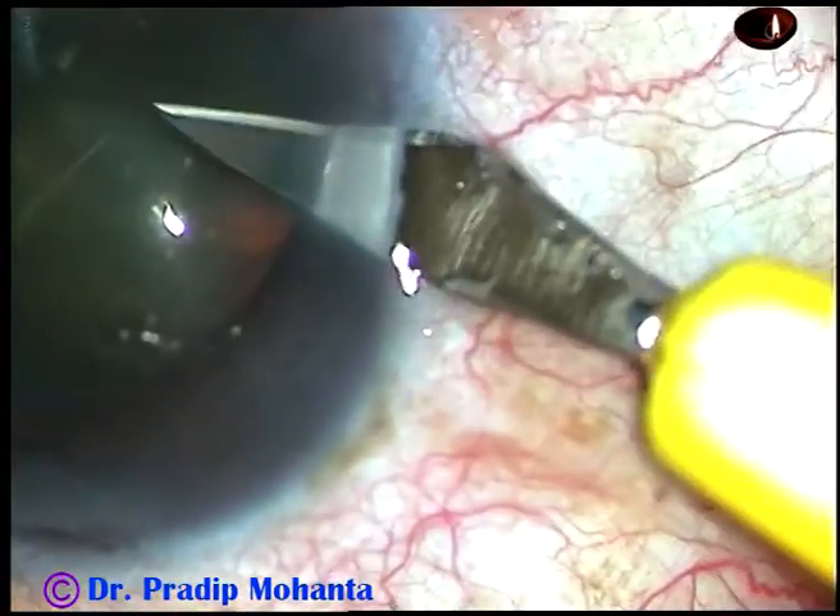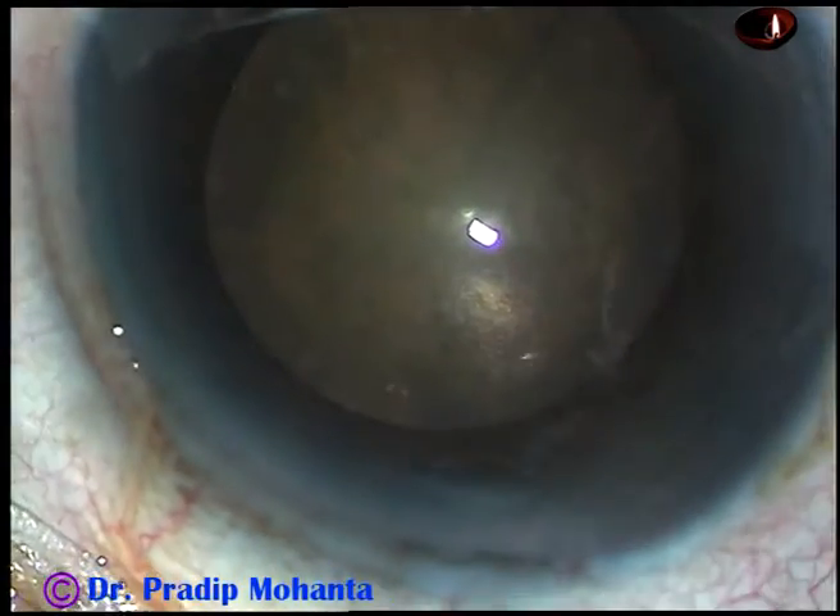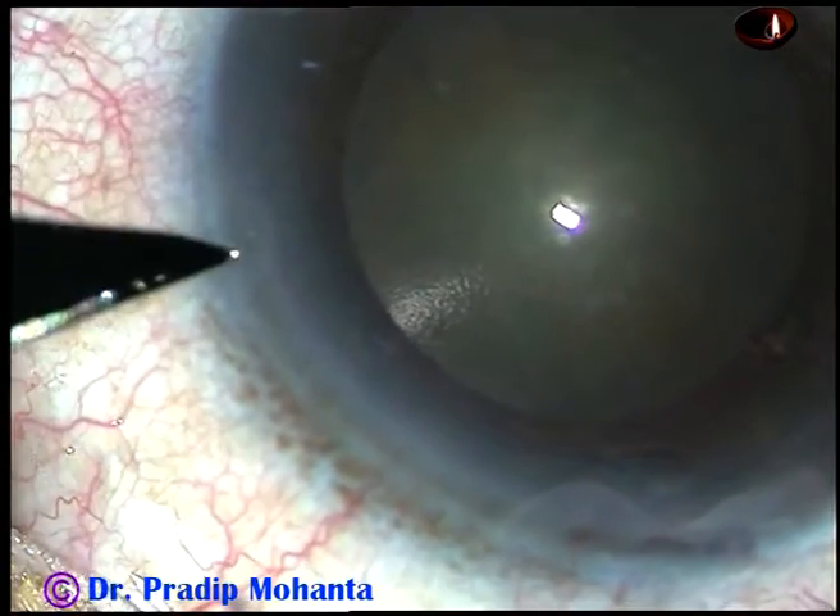Friends, this is a cataract with grade 2 nucleus sclerosis. Let us see the management of this case.